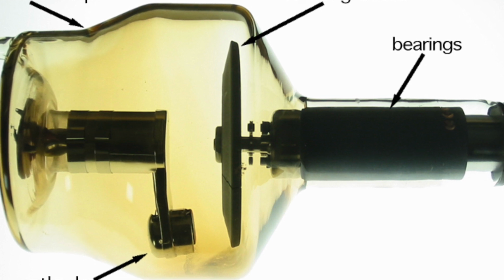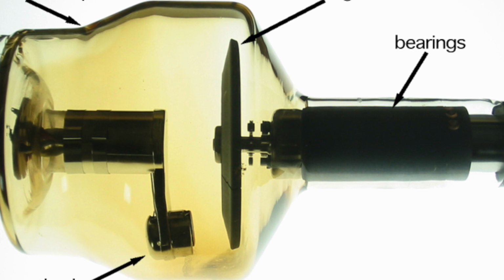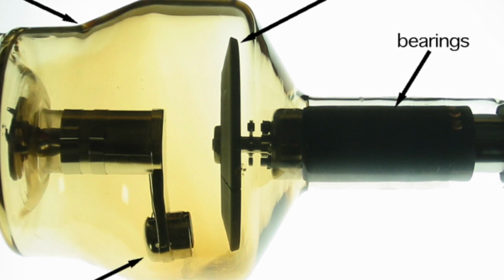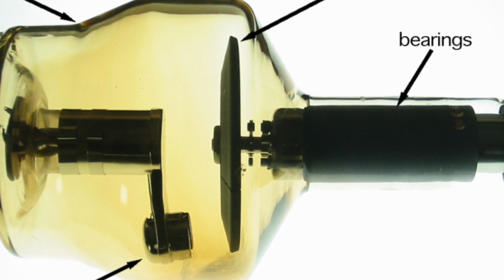And when the beam of electrons reaches the copper, it destabilizes the metal atoms, and as these metal atoms try to get back to a stable form, X radiation is emitted.